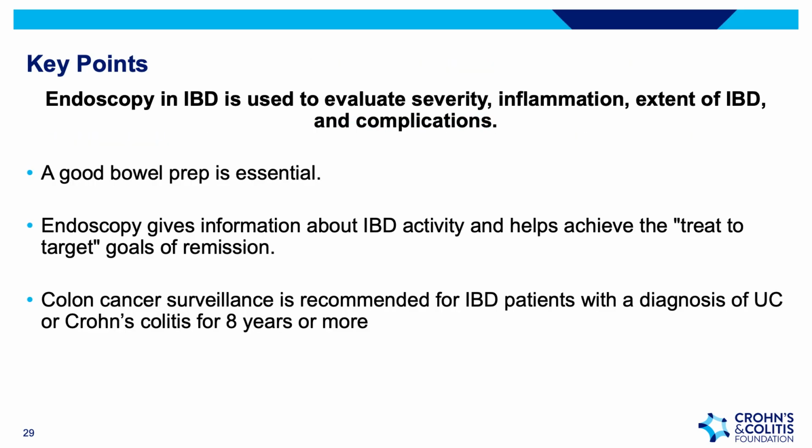In summary, endoscopy in IBD is used to evaluate severity, inflammation, extent of IBD, and complications. A good bowel prep is essential so the doctor can see the bowel wall lining clearly. Endoscopy is an important tool for physicians to understand a patient's IBD and response to treatment, with the ultimate goal of treating to the target of remission. Finally, colon cancer monitoring or surveillance is recommended for IBD patients who have had inflammation in the colon. This could be both UC patients and some Crohn's patients, with disease duration more than 8 years.